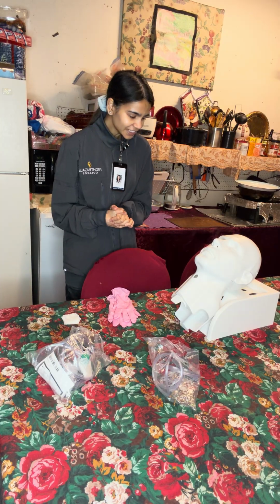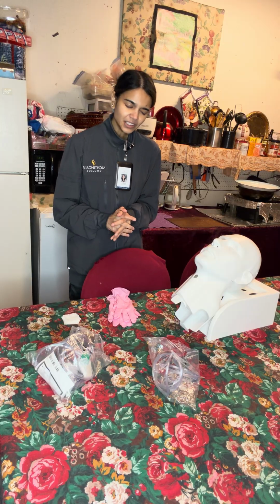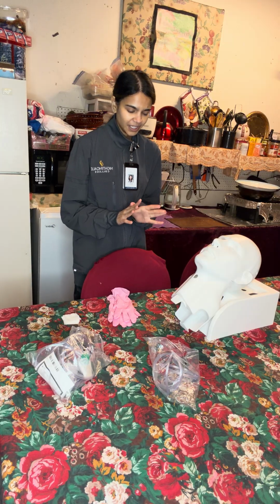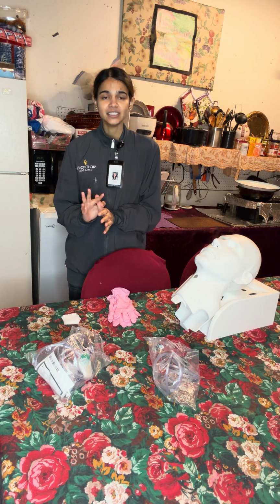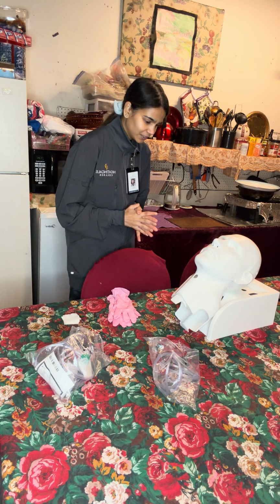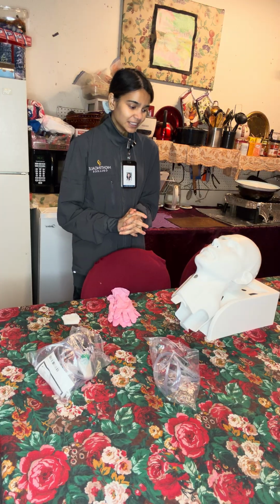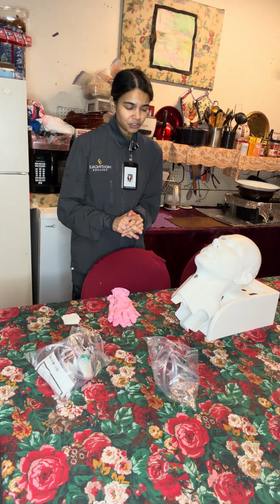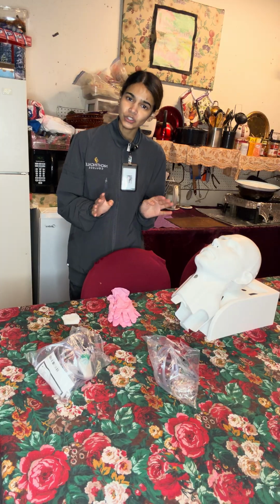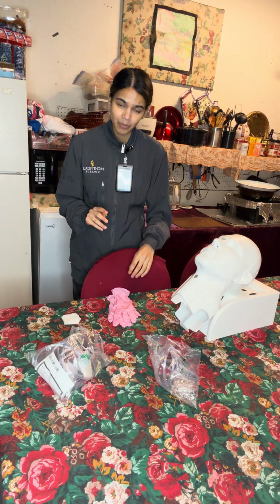The doctor has ordered oxygen therapy for you because your oxygen levels have been on the lower end. This oxygen therapy will ensure that your oxygen levels will go back to normal range. Do you have any questions for me? The patient has no questions, so now I will begin to do a respiratory assessment, which will take approximately 2 minutes to do. Once the assessment has been completed, I will then apply my gloves.